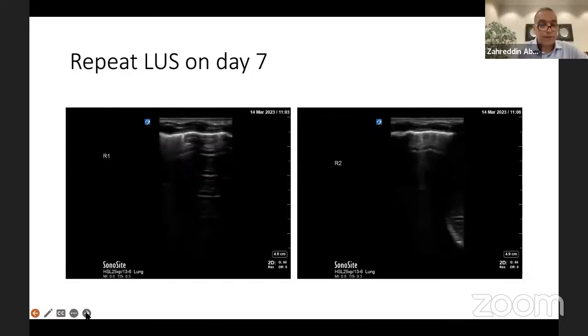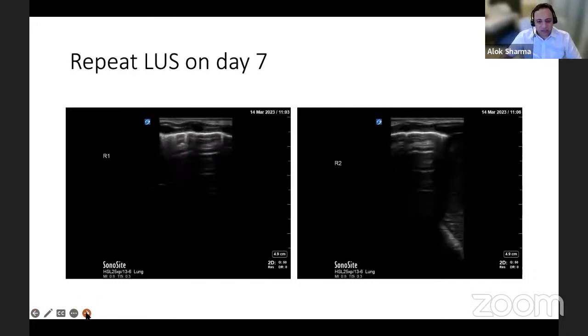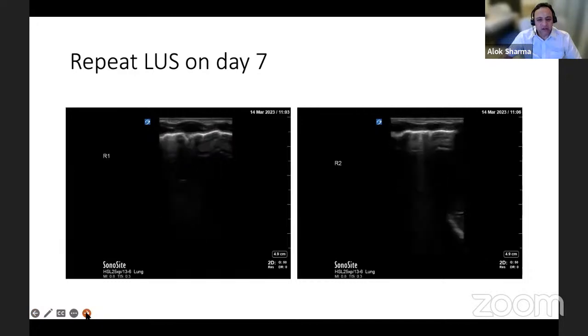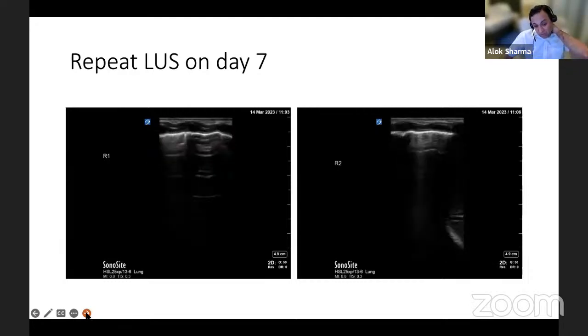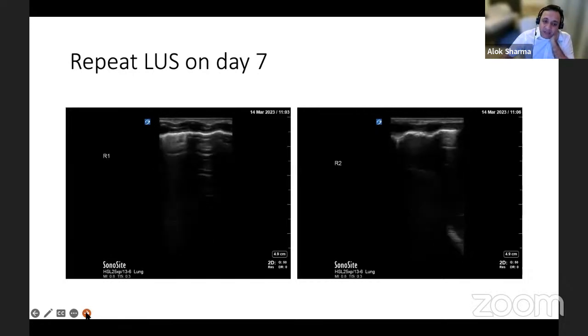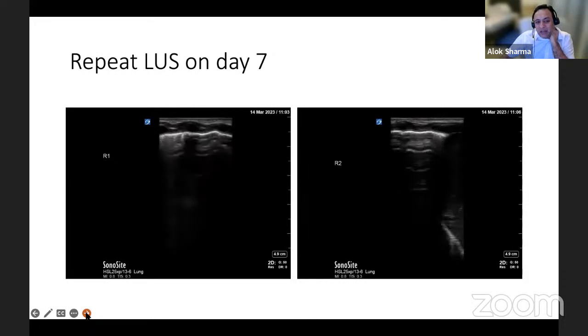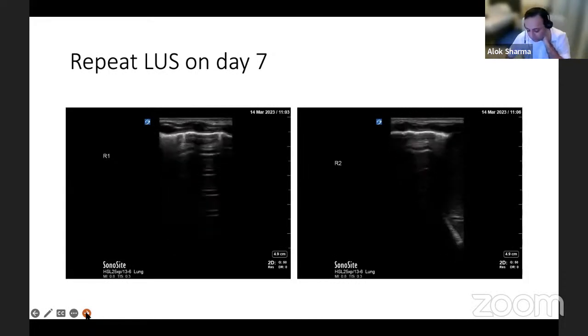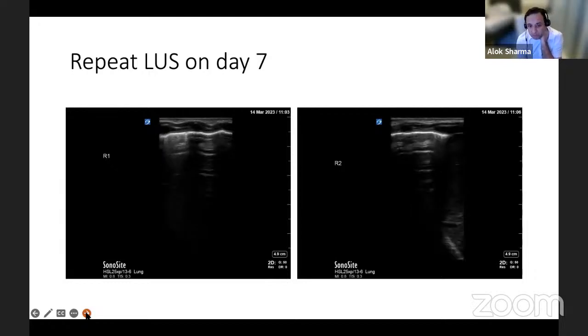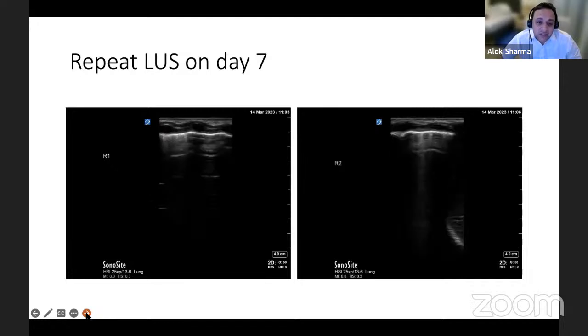Thank you. Which machine are you using, sir? Sonosite. Okay. So again, it's worth having a look at whether you have time gain compensation or lateral gain compensation, because they'll change the images slightly differently. One of them will be vertical. If you have the GE, it tends to have lateral gain compensation, so it moves and changes the image in a slightly different way. And in the GE, often you have to reduce the frequency to get slightly better imaging from the depth. But in the Sonosite, if you have time gain compensation, then you can do partial segments in every area, which is beautiful. It's a very nice machine.